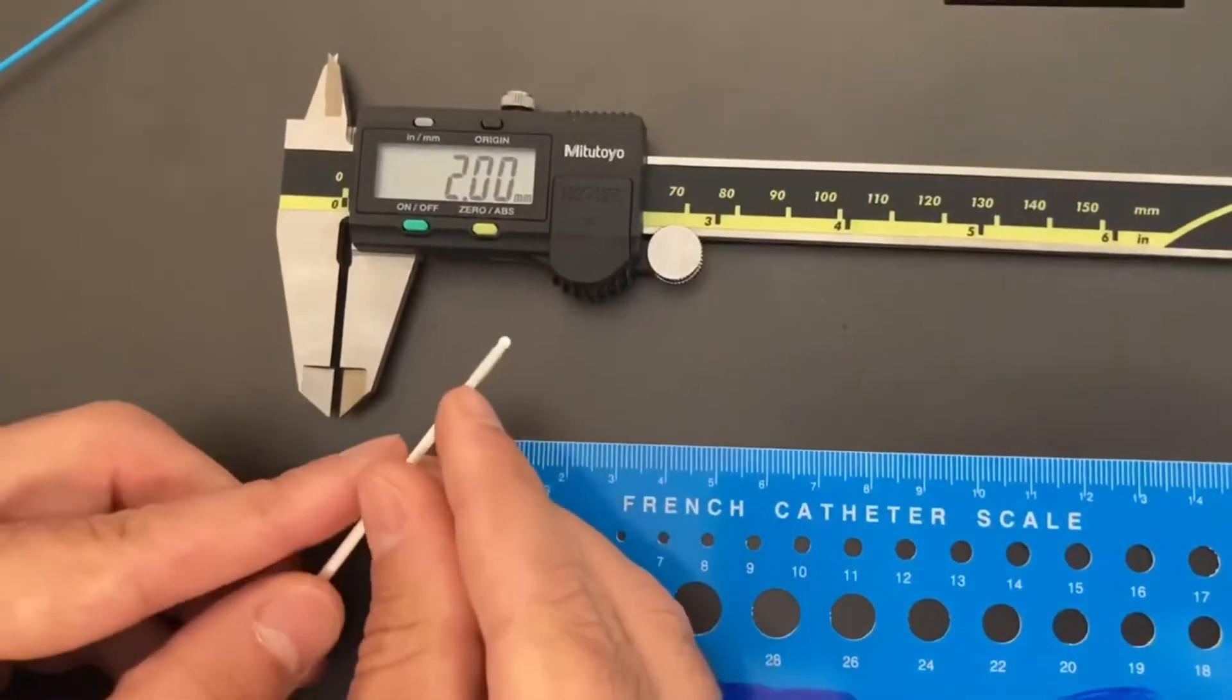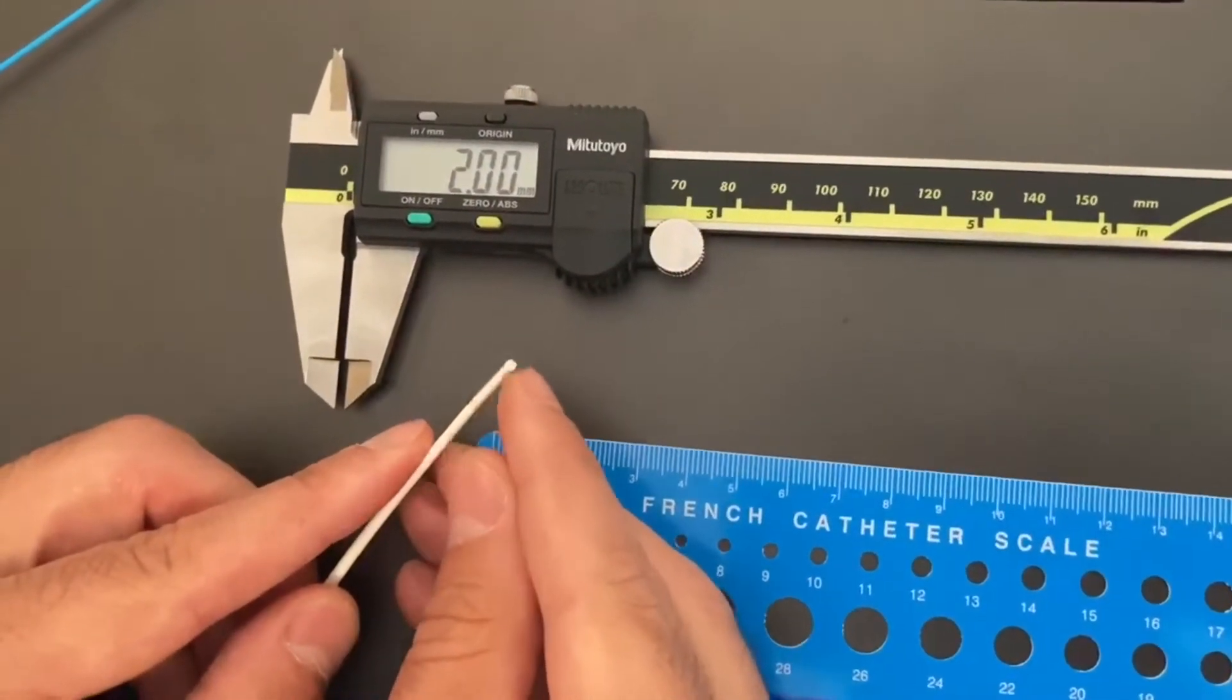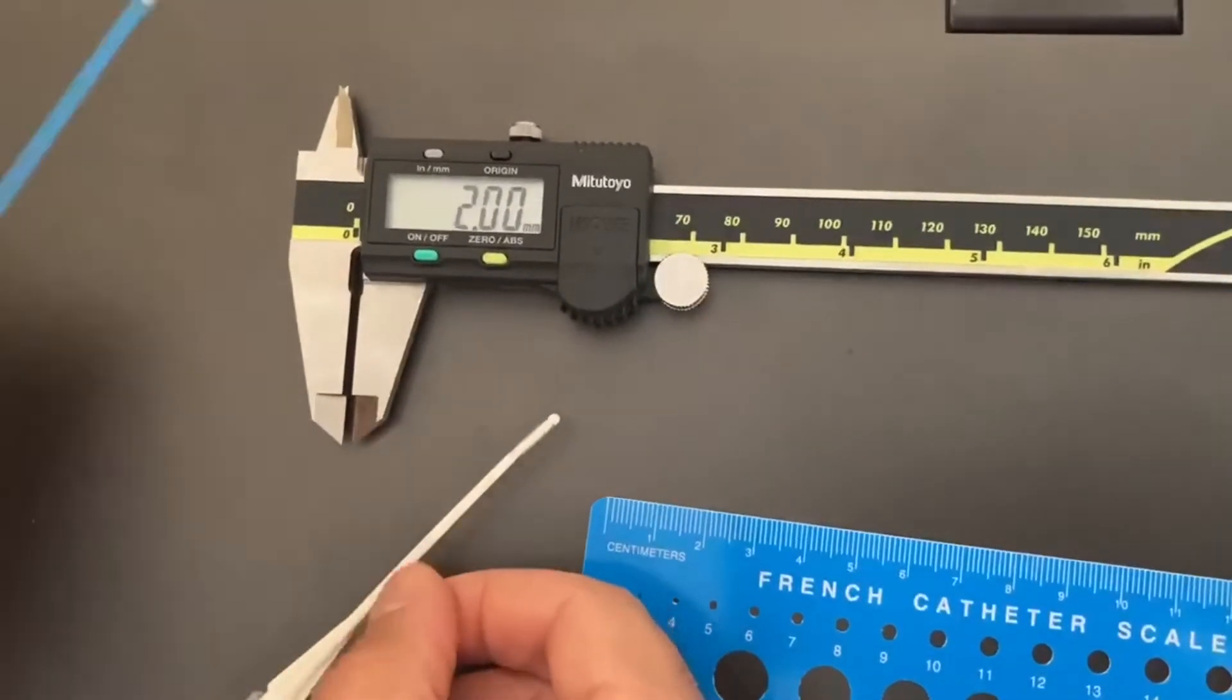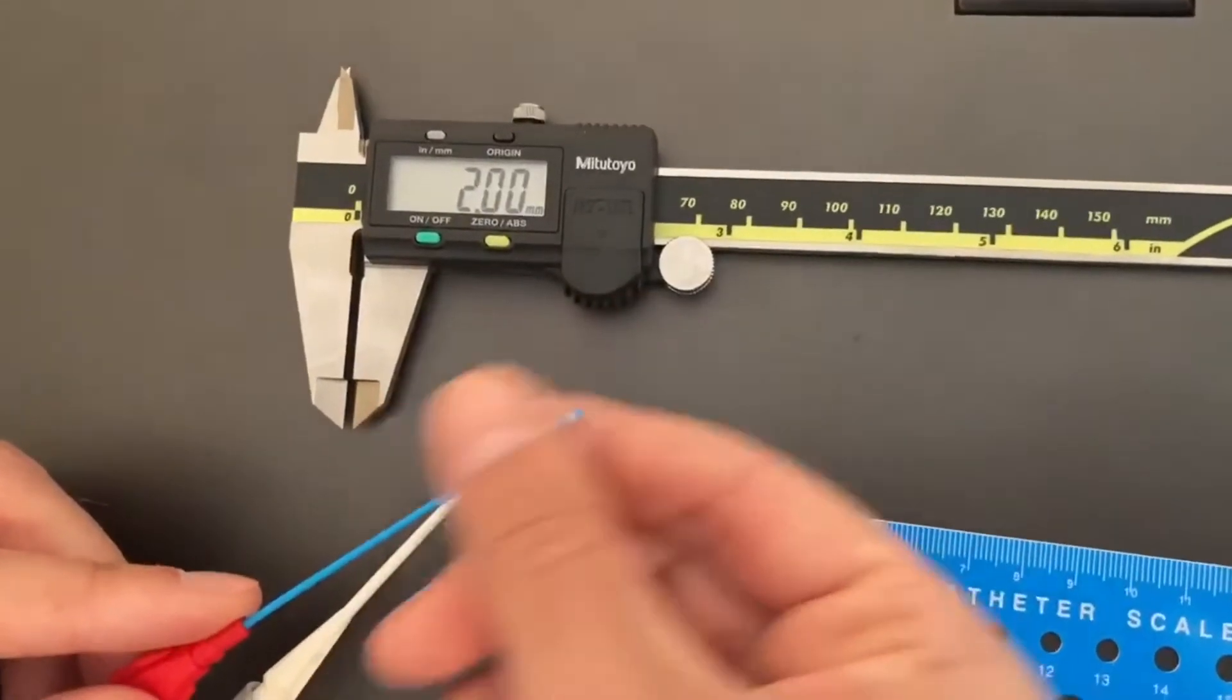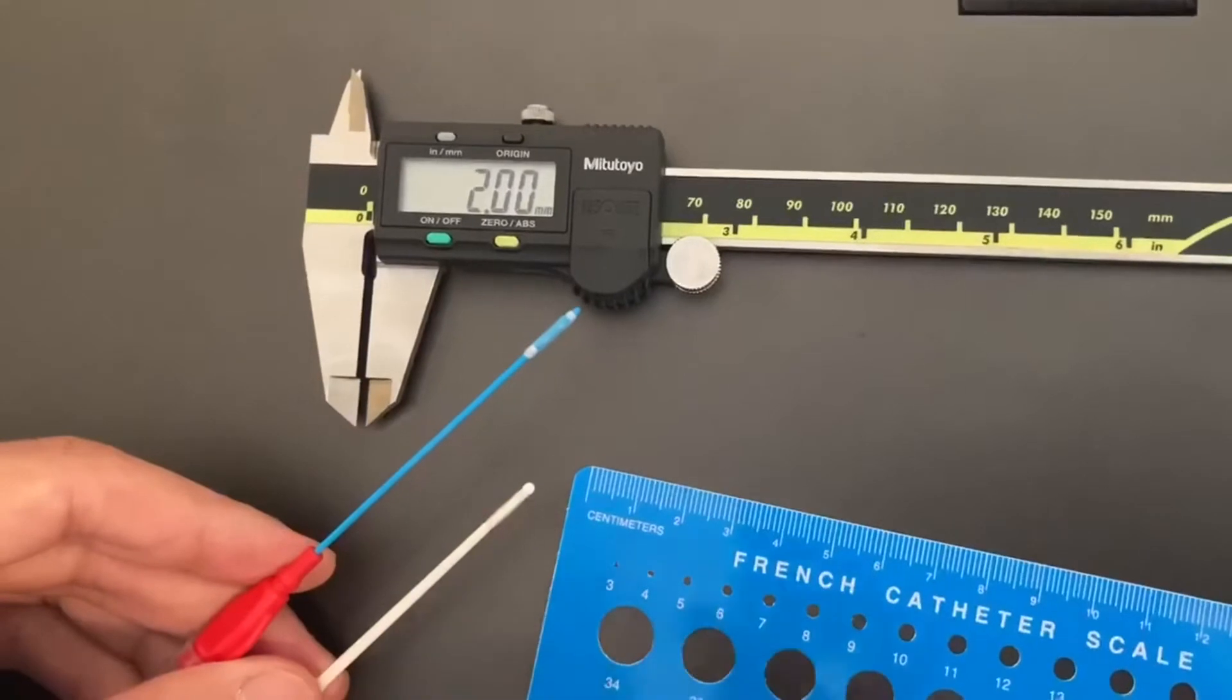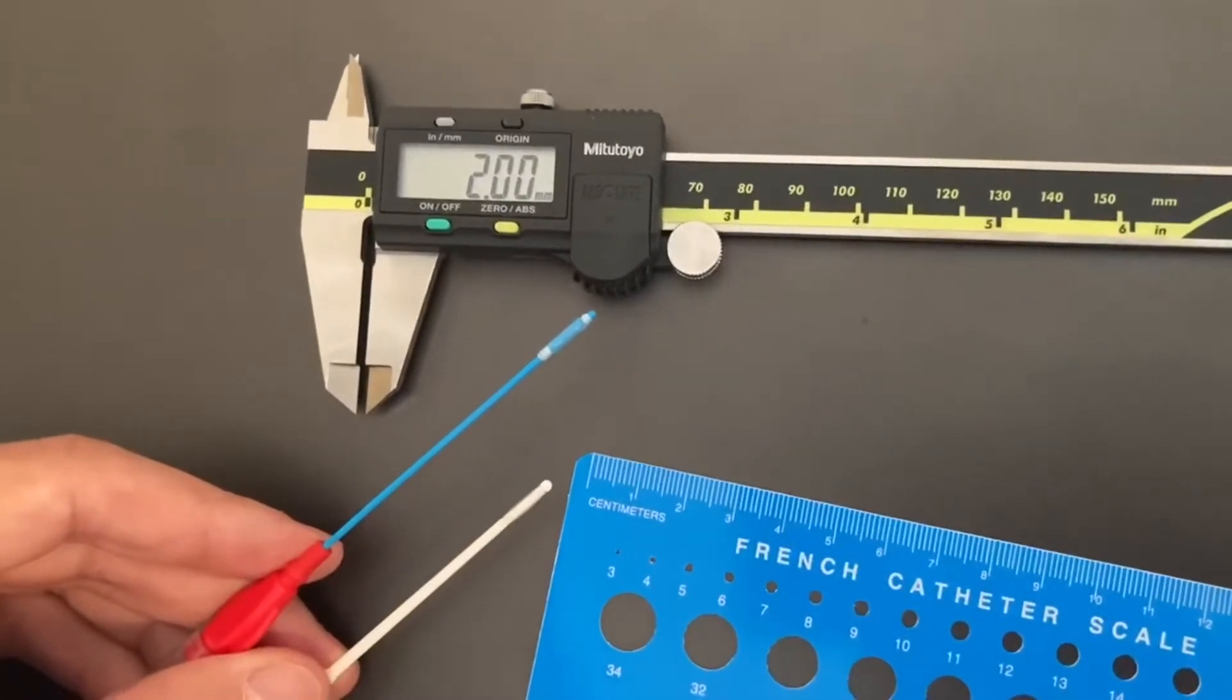Now the competitor also includes these two recessed areas on the catheter tip maybe to reduce the total width created by the string that ties the balloon in place. But in practice it feels no smoother than the balloon extractor which we carefully hand tied kind of like you would a fly fishing lure.